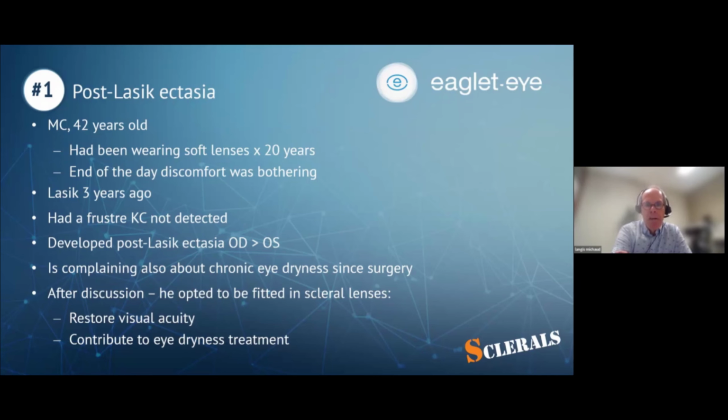He had been wearing soft lenses for the last 20 years, and he was complaining, as many other patients, I would say, of discomfort at the end of the day. He had LASIK 3 years ago because of the discomfort provided by contact lenses.